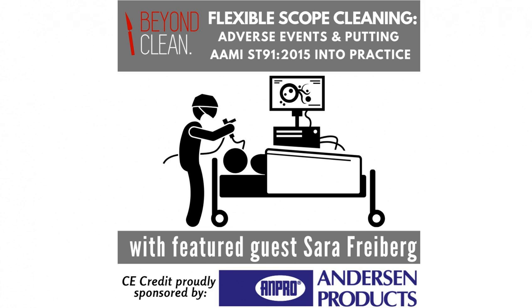If we remove the leak tester while the scope is placed in the sink of water, we risk the potential of flooding that scope and potentially causing extensive damage to the internal and electronic components. It's important to note that prior to sending a scope in for repair, we protect the user, transporter, and receiver of that scope from any potential infection issues. As mentioned, keeping that scope connected to the leak tester, we would proceed with the manual cleaning and high-level disinfection steps as outlined per the scope manufacturer IFU.